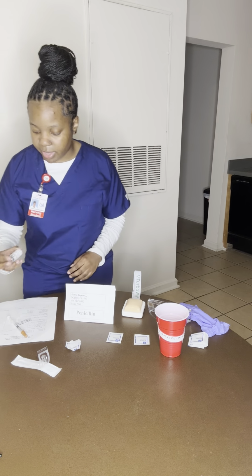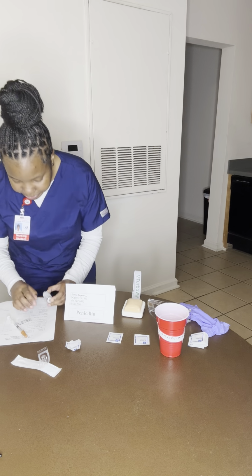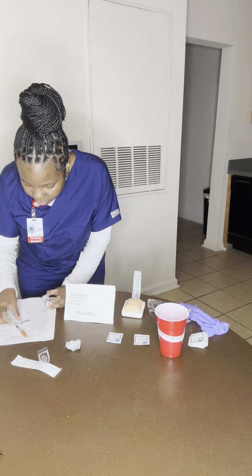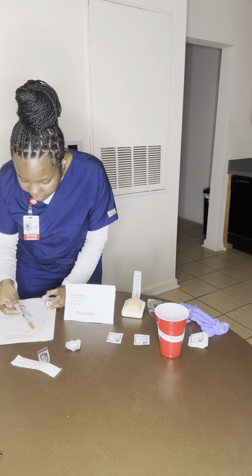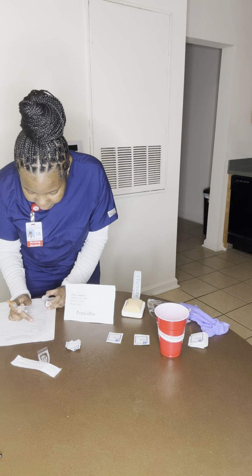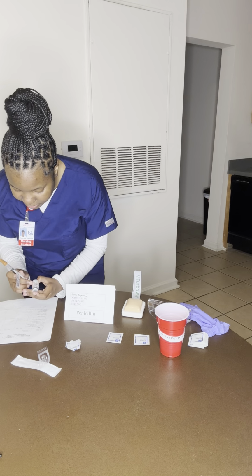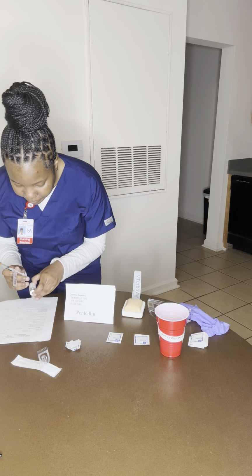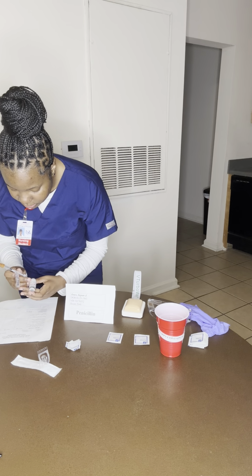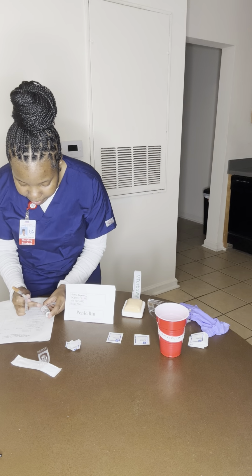So I'm going to take this vial and compare it to the MAR. We have an order for heparin 5,000 units subcutaneously every 12 hours. In this vial we have heparin 10,000 units per milliliter. Expiration 12/5/2025. So we have heparin.